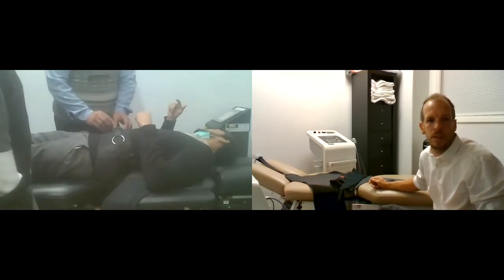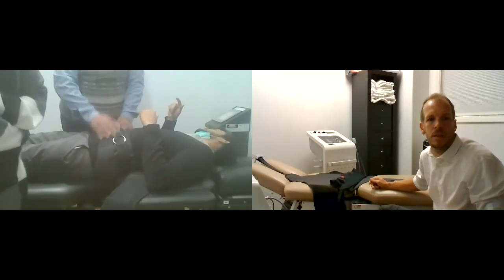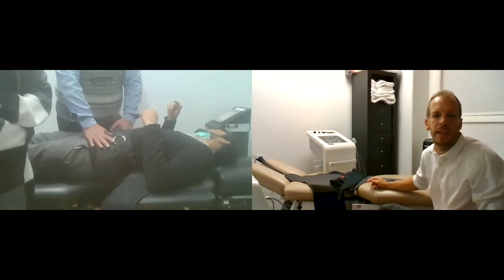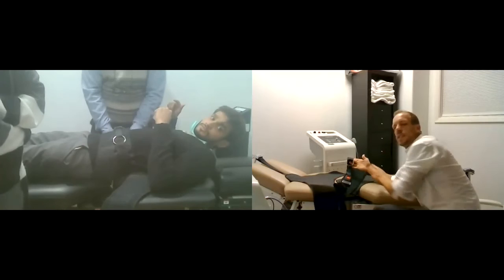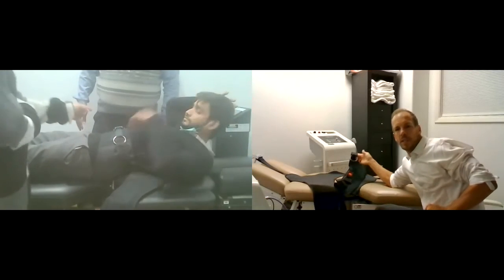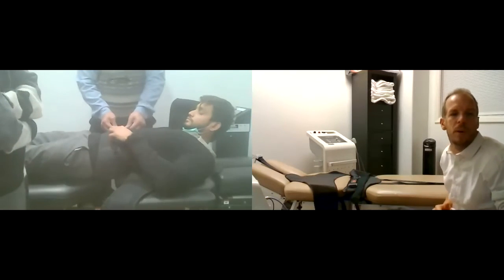Mr. Bright, I mean now apparently it seems just as tight as the belt is. Okay, that's fine. Now you want this metal ring, you want this to be centered on the patient. This one. Okay. There you go, perfect.